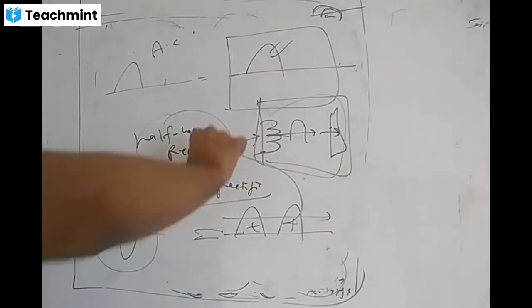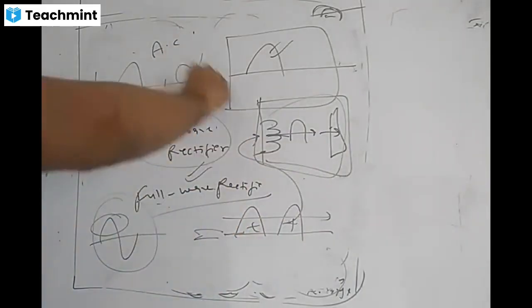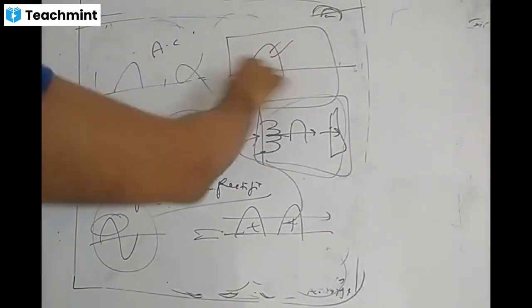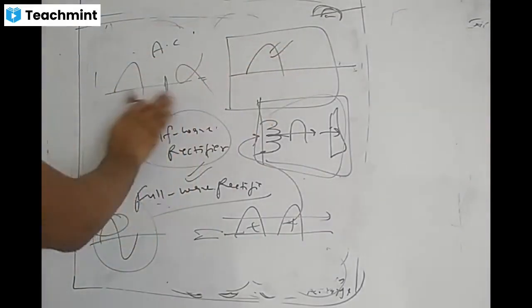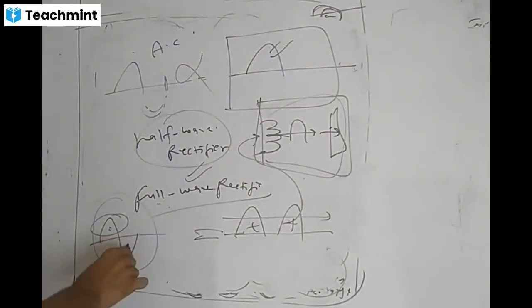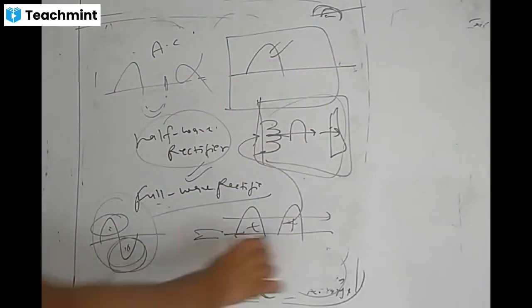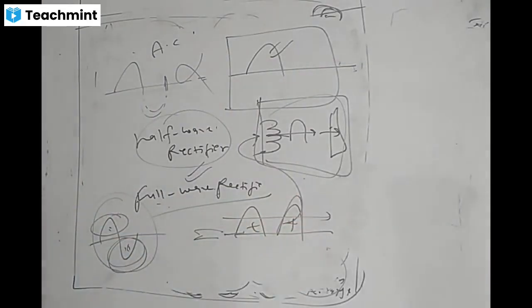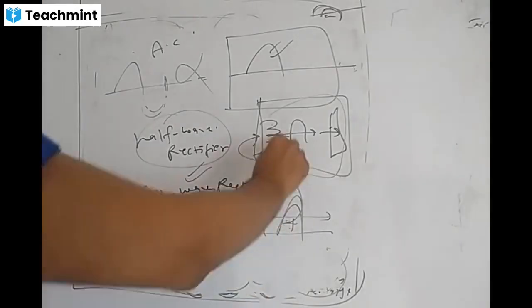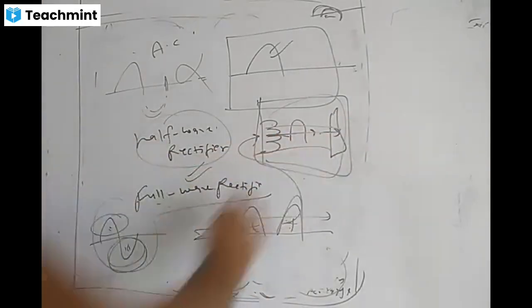So this is called rectification, where half wave wastes part of the cycle. If you want to utilize both parts of our alternating current, then convert this into something useful. So if we convert this, we are getting everything from filament to anode.